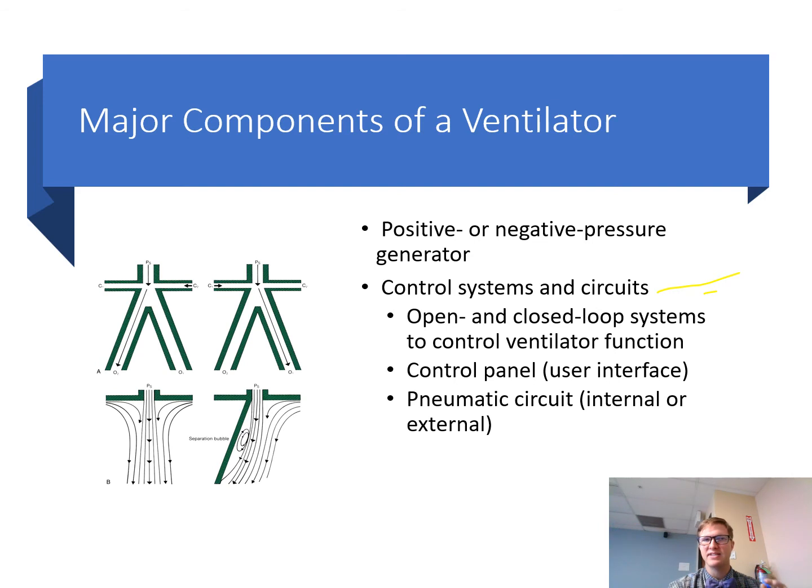So when we're looking at these, we can see that there's an advantage to adding a microprocessor, right? Microprocessor technology has allowed us to get new generations of ventilators that give feedback loop systems. Most ventilators that do not use microprocessors are called open loop systems, which means you set the control like a tidal volume, and the ventilator delivers that volume to the patient's circuit.